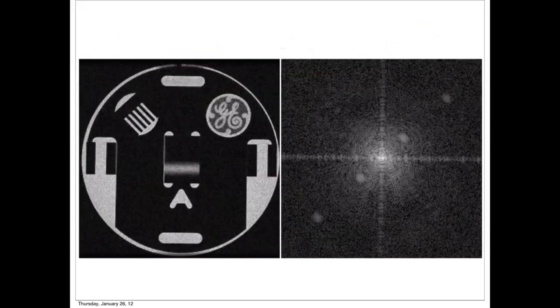Is it true that static electricity can sometimes cause them, and what else? Yeah. Anything that arcs, sometimes you have arcing due to various reasons. Gradients switch very quickly, they create huge voltage differences that can spike. Sometimes the RF coil connector, sometimes connectors can be not great, so they can spike, things like that. Sometimes there'll be electricity spiking and all sorts of stuff.